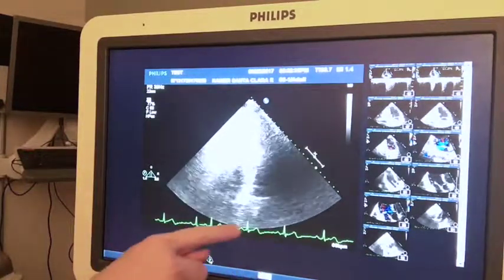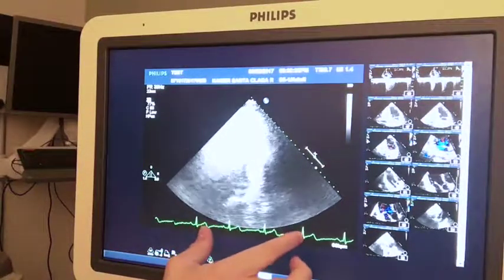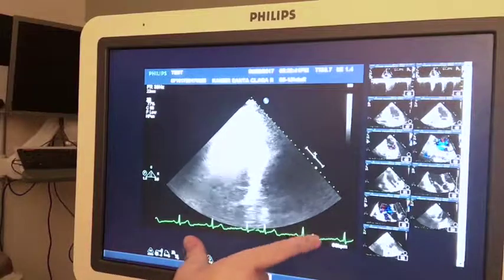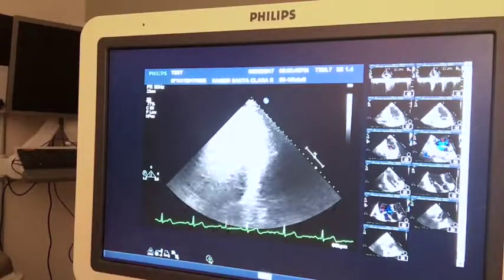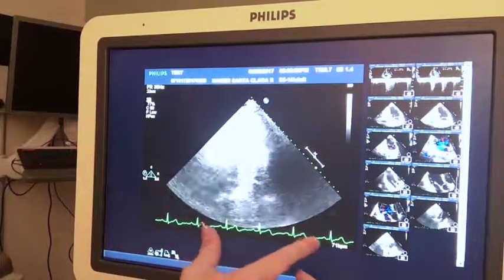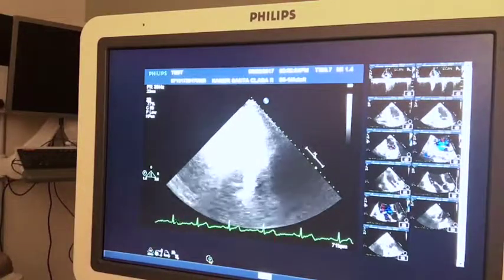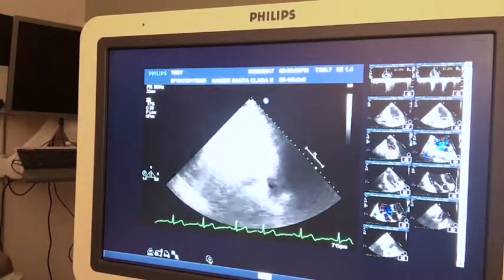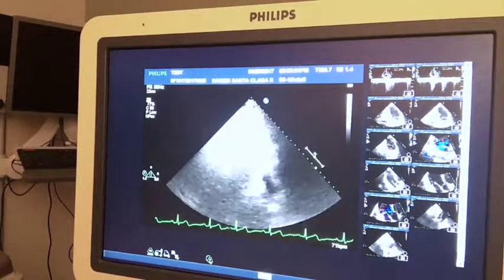Normally, most of the time, we have these on a beat-to-beat cycle where it's going to capture 2 beats. So if they are a bradycardic heart, taking a long time in between heartbeats, and you ask them to hold their breath, sometimes it may take a long time before the first QRS. That long time is time that they are starving for air, they think they're going to pass out. So time well and gauge appropriately based on the patient.